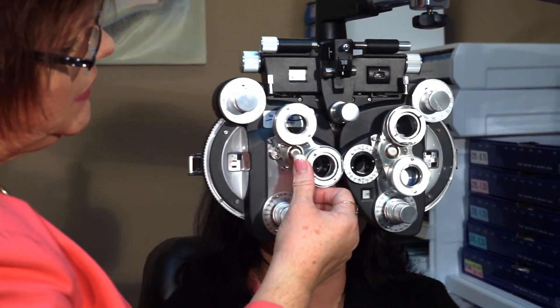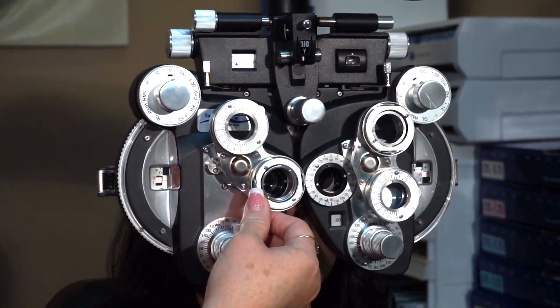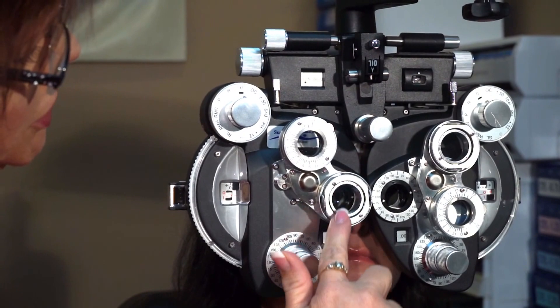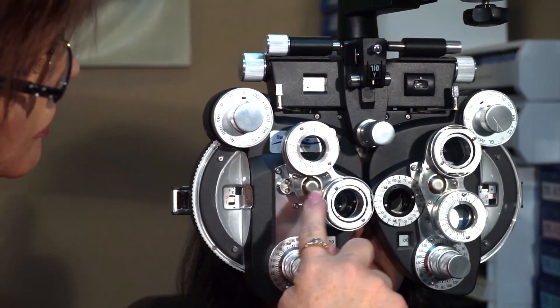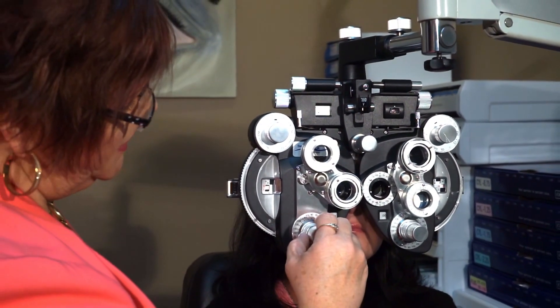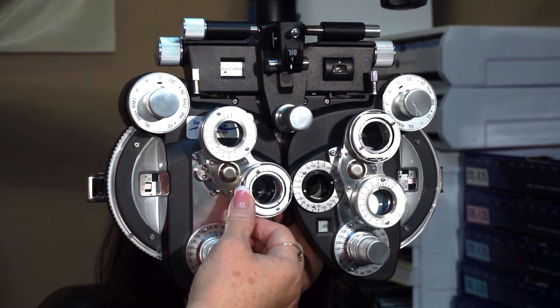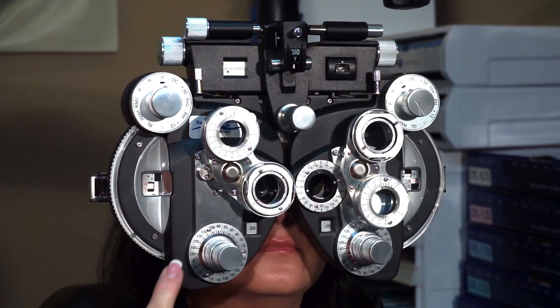Which of these is sharpest, Lori — lens one or two? One. So I'm going to turn it to the side she said was clearest and chase the white dot. Here's my axis right here, and the white dot is in this direction, which tells me I need to turn the axis towards the white dot. If you work in plus cyl, you chase the white; if you work in minus cyl, you chase the red. I'm going to turn it 10 degrees towards the white dot, now at axis 170. Which is sharper and clearer, lens one or two? One. She again chose the lens with the white dot on this side, so her axis is more in that direction.